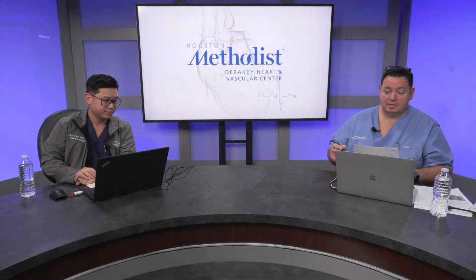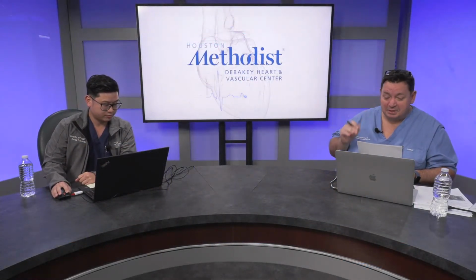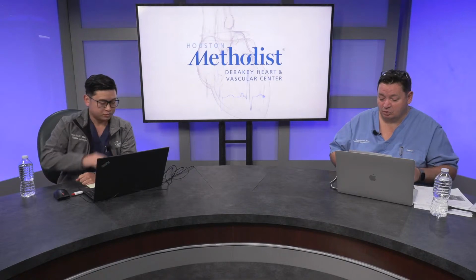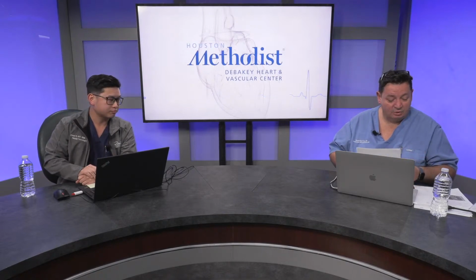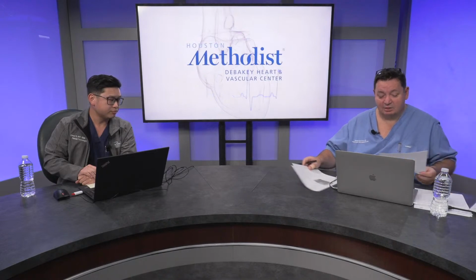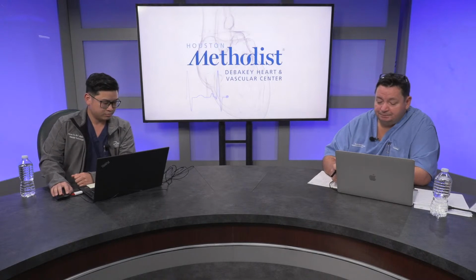Let's close this one. I think the introduction, I kind of mixed the two cases together. I'm very sorry. So this was a 62-year-old patient and was a pre-op evaluation before a valve surgery. The introduction I did is basically for the second case. So the second case is the one with the left MCA infarct.